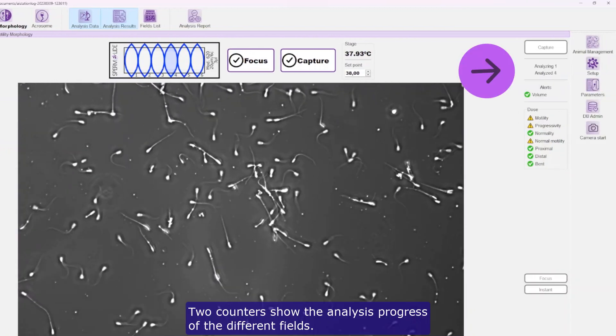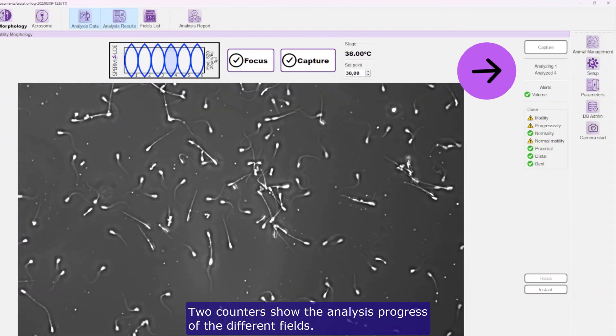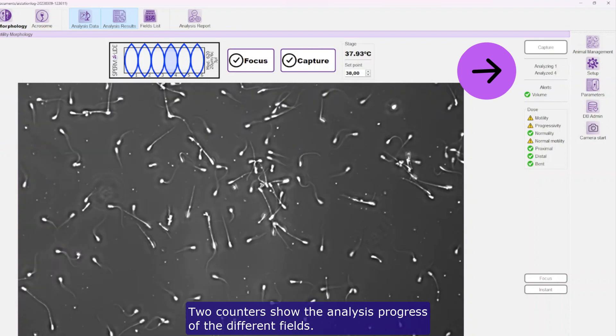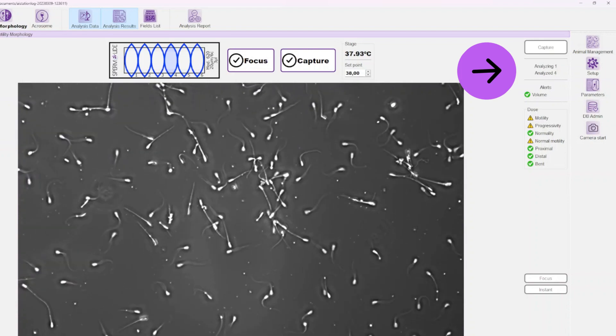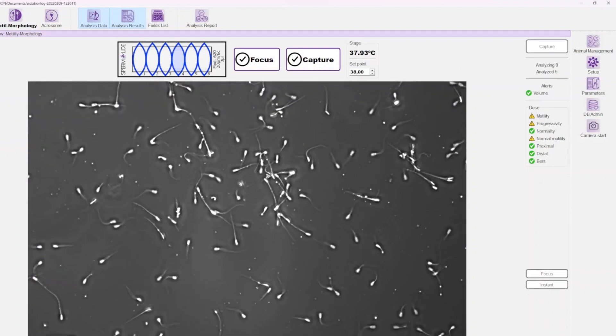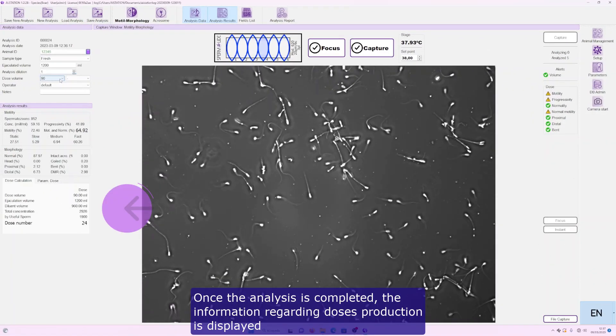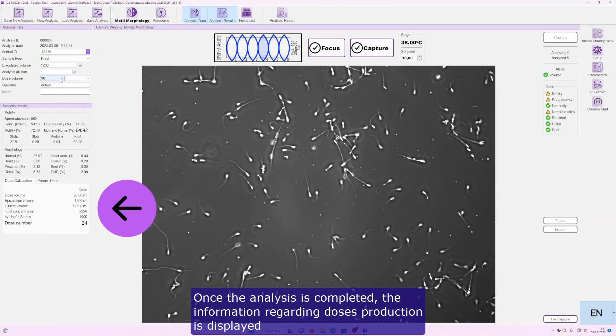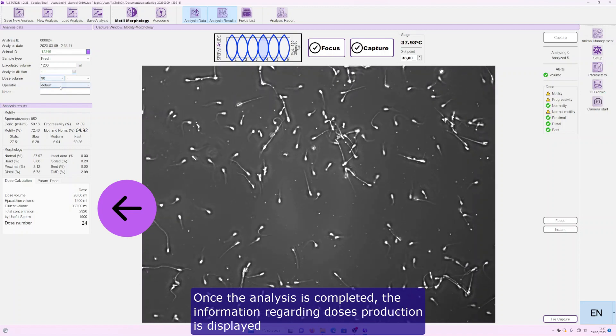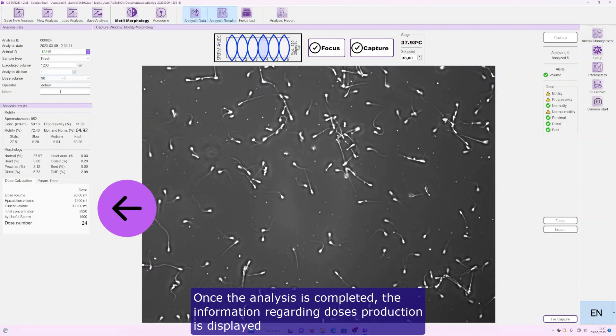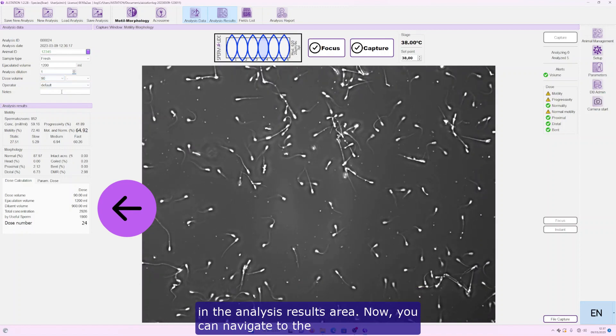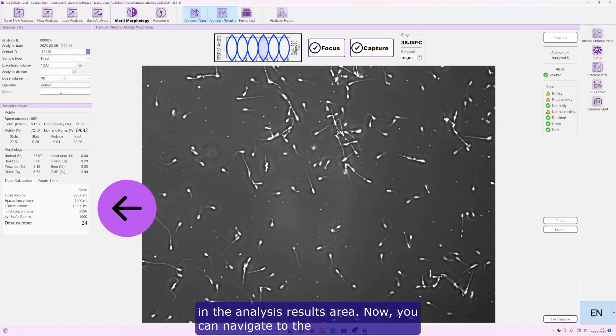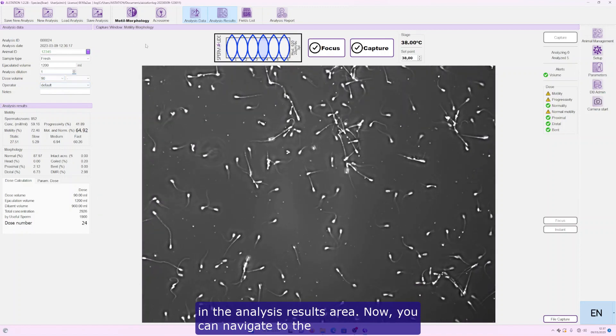Two counters show the analysis progress of the different fields. Once the analysis is completed, the information regarding doses production is displayed in the analysis results area.